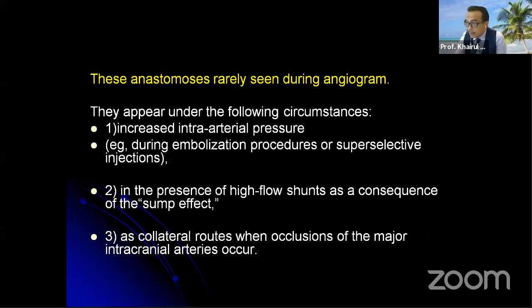Kiripong. Why is this anastomosis very difficult to see? There are a few reasons. Just remember that you saw Dr. Kiripong embolize the meningeal just now. They appear under the following circumstances.